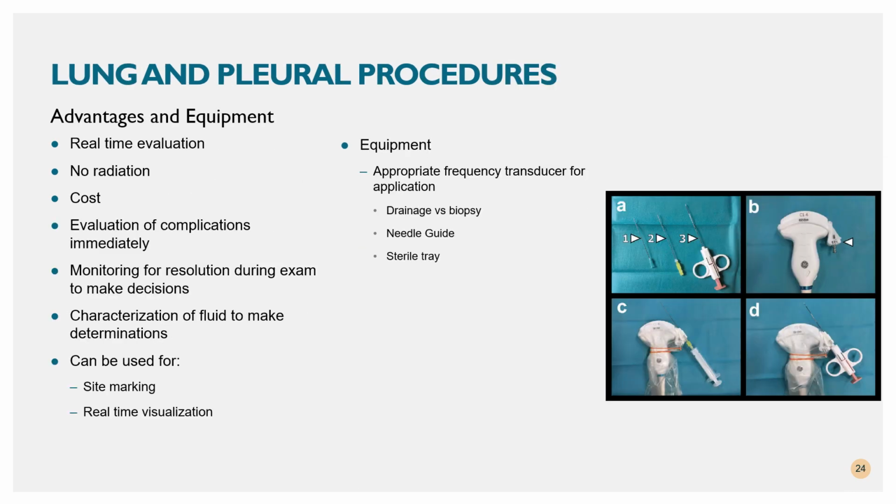Okay, so pretty limited evaluation of the diaphragm, but it can be useful, and especially in that excursion assessment. Now we're going to look quickly at lung and pleural procedures.